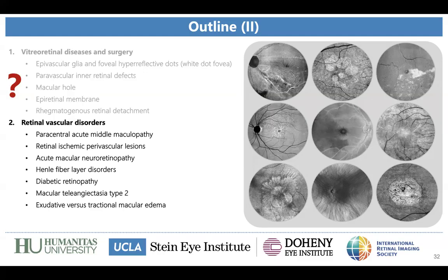Leveraging what Ricardo brought to light, the segmentation: from a research standpoint, how do you deal with the segmentation issues that we have, mainly in wide slabs like 12 by 12, when you are doing research and the built-in software can't appropriately segment the OCT en face? When you're dealing with high-volume exams, where you need to analyze a lot of images, how do you deal with that?